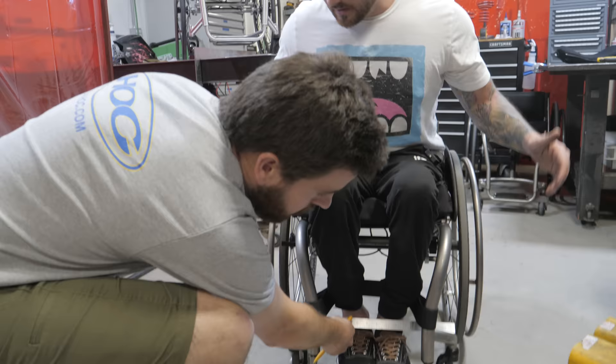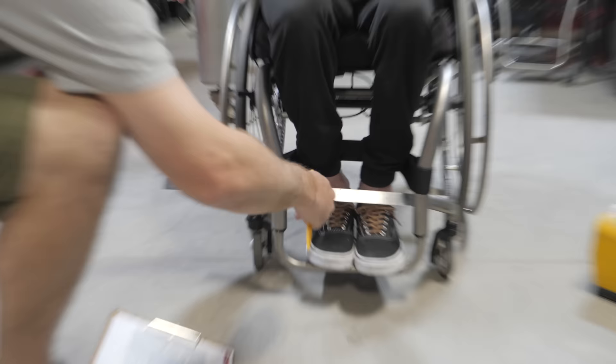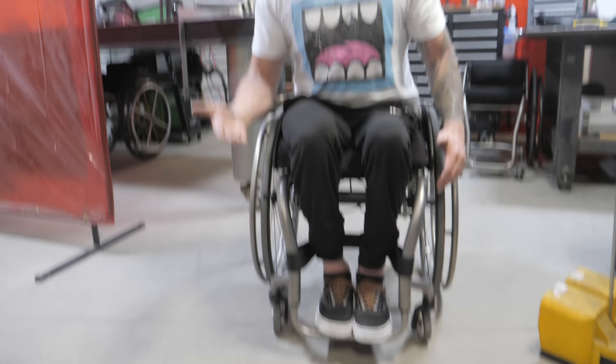Now Eric is going to take the measurement of the caster width. The more narrow your caster, the less doors you're going to bang into because the casters are more inside than your actual wheels. The only caveat is you'll be a little bit more unstable. The wider your caster width, the more stable you'll be, but the more things you're going to bang into and your turn radius — especially spinning in a tight bathroom — is going to be less.